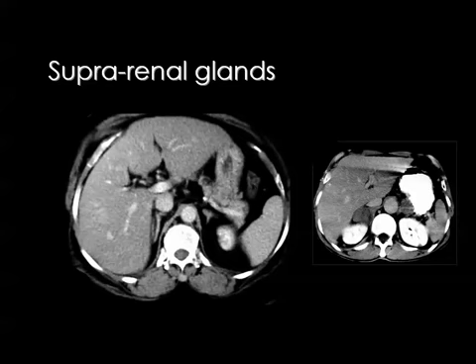while they are examined by a specialist. And we usually depend on the technician. And so we give him instructions to continue the scan until he can see the suprarenal gland. And the suprarenal gland is like an inverted Y above the upper pole of the kidney. And this is the right suprarenal gland, and this is the left one. And this is an example of bilateral metastatic deposits in the suprarenal glands from a case of bronchogenic carcinoma.